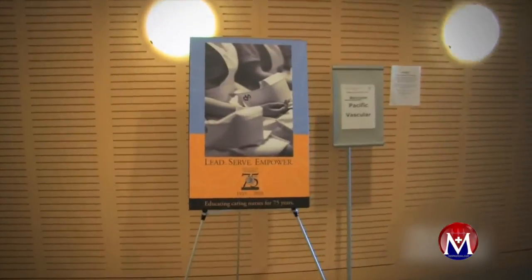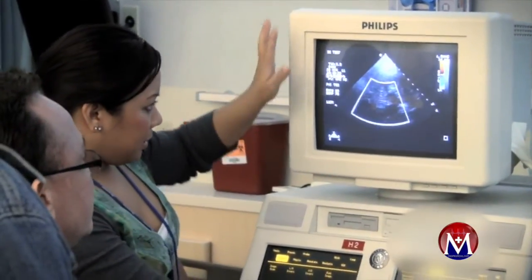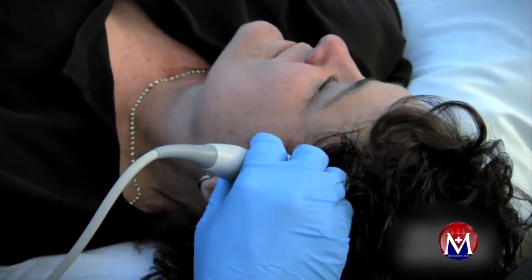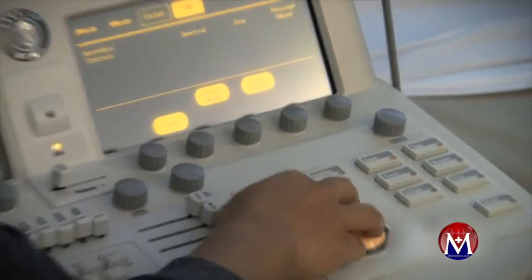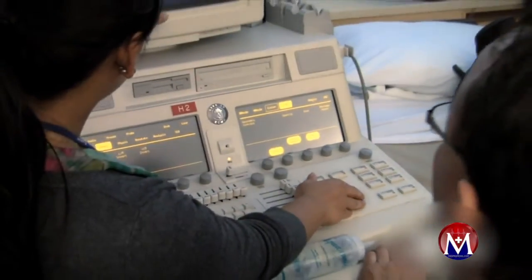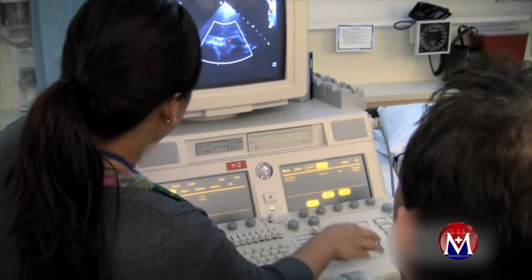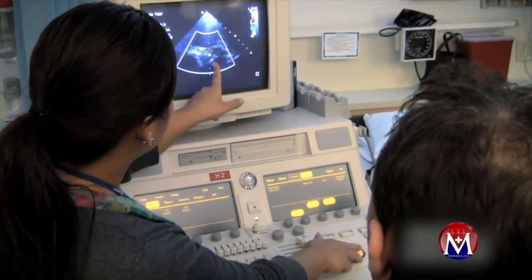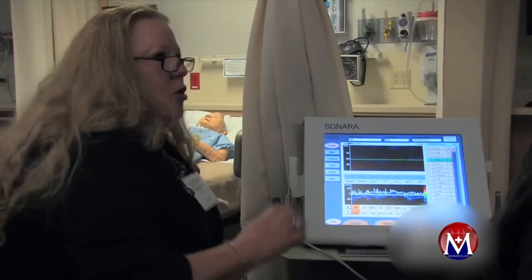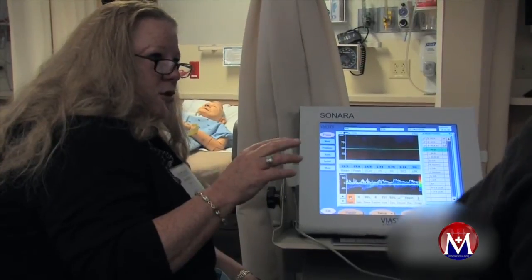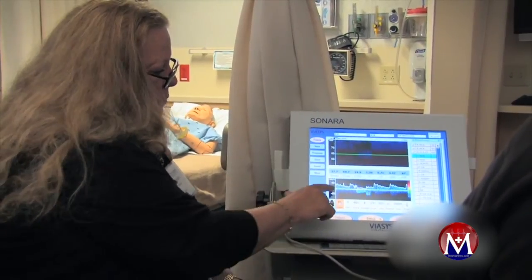This is midline — anything on the other side is the contralateral side. When we put color on, it should light up. We sample every half centimeter or every centimeter. The deeper you go, you'll start to see the ACA, which would be in blue, going off in this direction. You have a very good image of the P1 segment here, and you can see it wrapping around — with a slight twist I can get P2. Always use your MCA-ACA bifurcation as your landmark; that's your terminal ICA. Come back up and you'll get your ACA coming in.